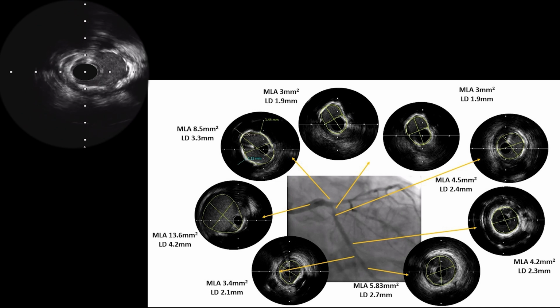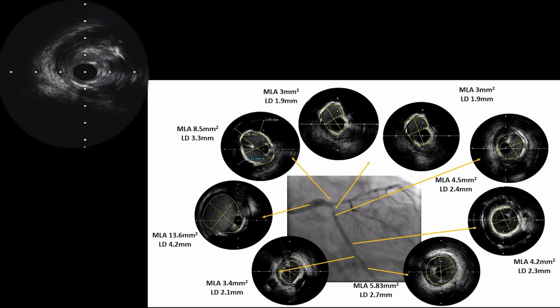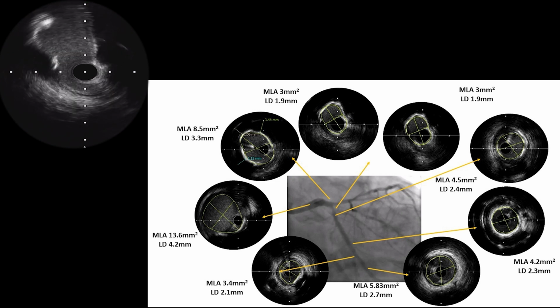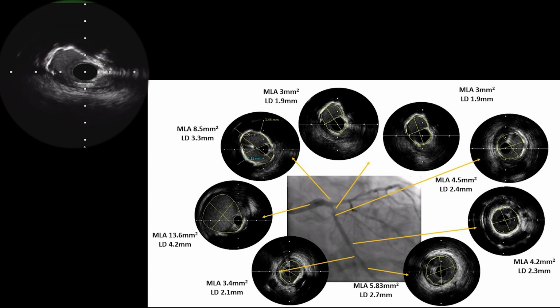This is the previous stented segment. There is a calcium, LCX ostium, very severe plaque. You see the very tight, severe calcium, that is the LAD. You can see the wire in the LAD. So this is the LCX ostium. LCX ostium is severely calcified. You can see almost 270 degrees. Eccentric plaque, and you can see this is the eccentric plaque.